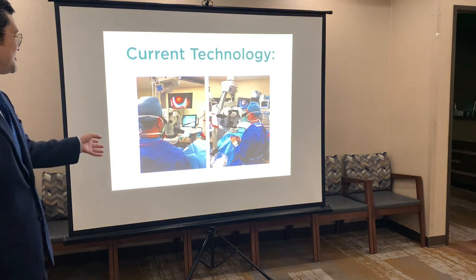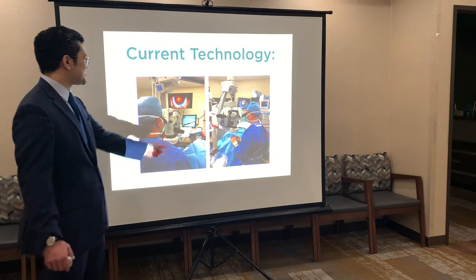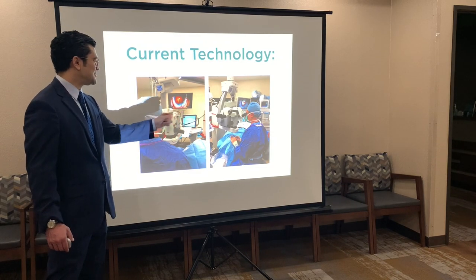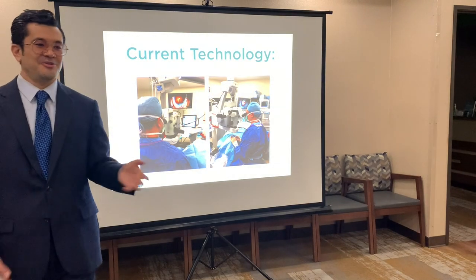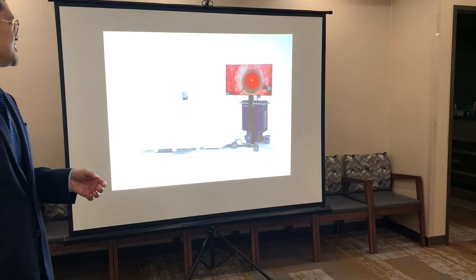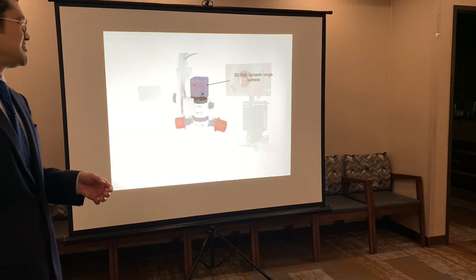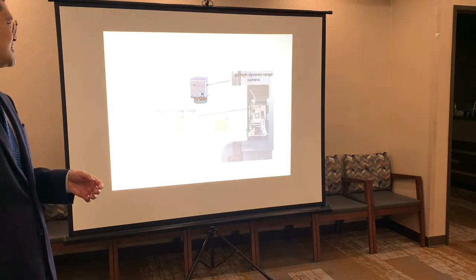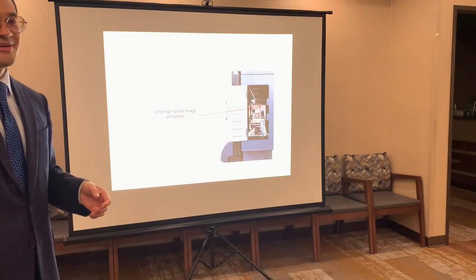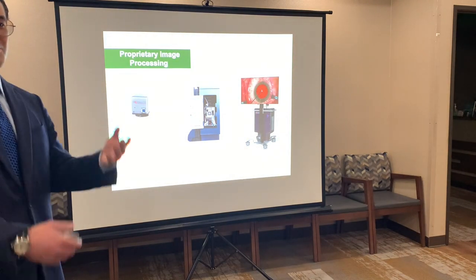So right now, look at all this. We've got cables, we've got the microscope, and you can see what I see if you're a nurse in the room right there, but it's not in 3D. You don't get to see the whole thing. So the new technology is going to display it on a screen here, and there's a little camera, and then there's a processor, and these three pieces give us 3D imaging.